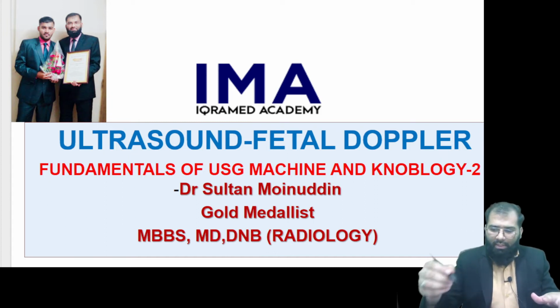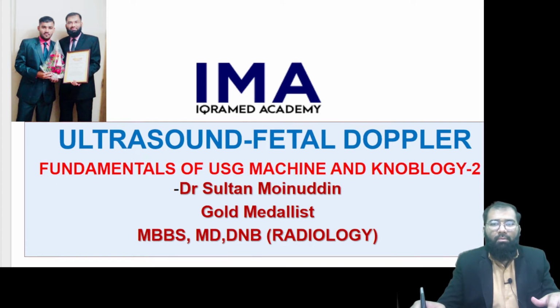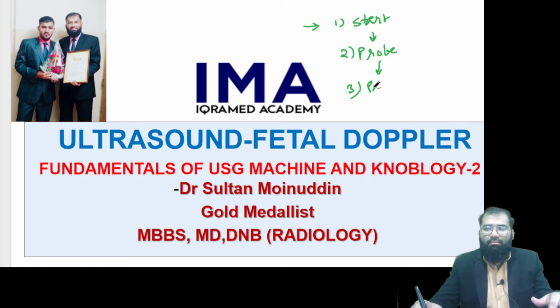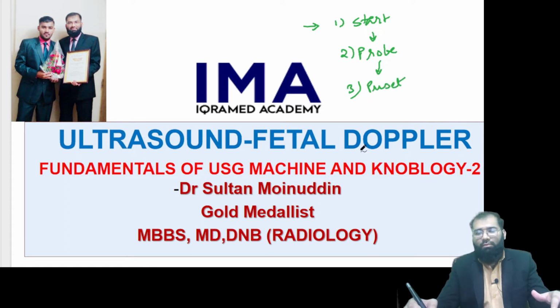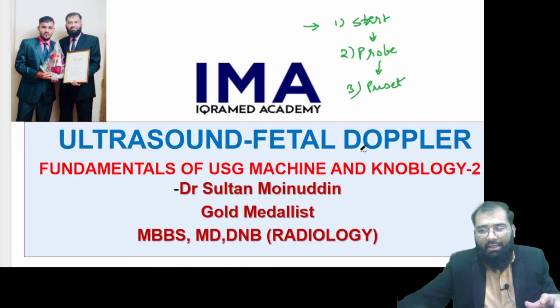Okay, so if I want to summarize my entire session from the last time, it can be summarized as: number one, you have to start the machine. Number two, you have to select the right probe, which is the convex probe in case of OBS scan, OBS Doppler scan. And third, very important, you have to select the right preset. So this is how we start, and now we are moving ahead, that is we'll be discussing Knobology Part 2. So without any delay, let us start.